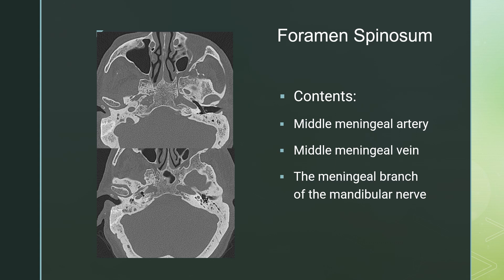Foramen spinosum contains the middle meningeal artery and vein, as well as the meningeal branch of the mandibular nerve. The easiest way to find foramen spinosum is to look for foramen ovale and then look for the small foramen posterior and slightly lateral to it. Here is foramen spinosum on a temporal bone CT on the left side, and here is foramen spinosum on CT — on the right side, here is foramen ovale anteriorly. Whenever I look at images of the skull base, even on temporal bone CTs, I always look to make sure there's an ovale and a spinosum on both sides.